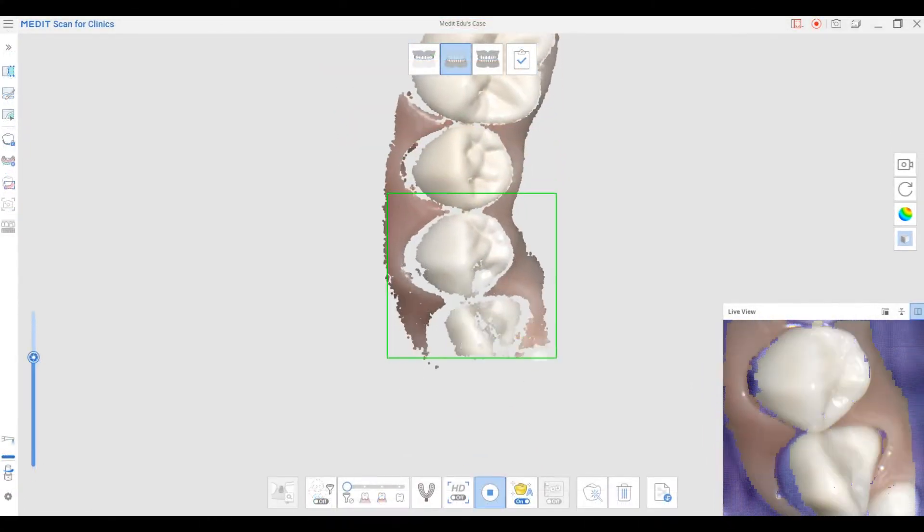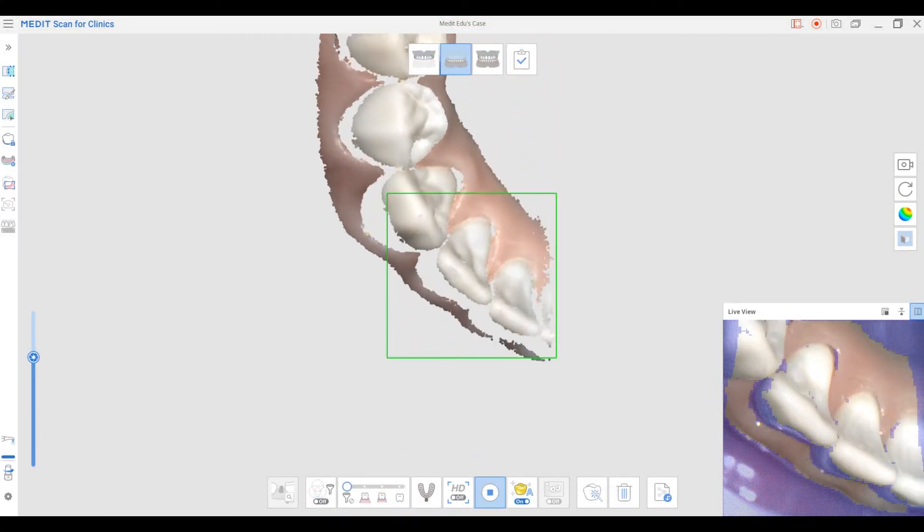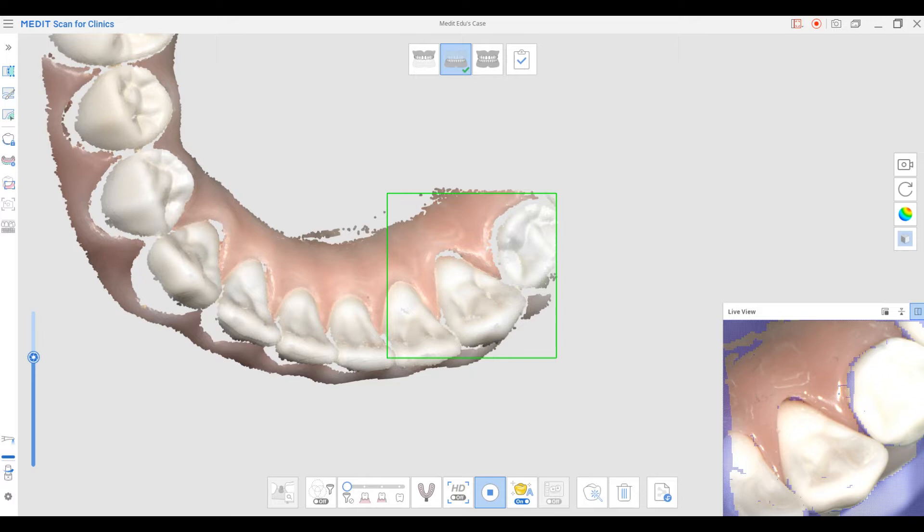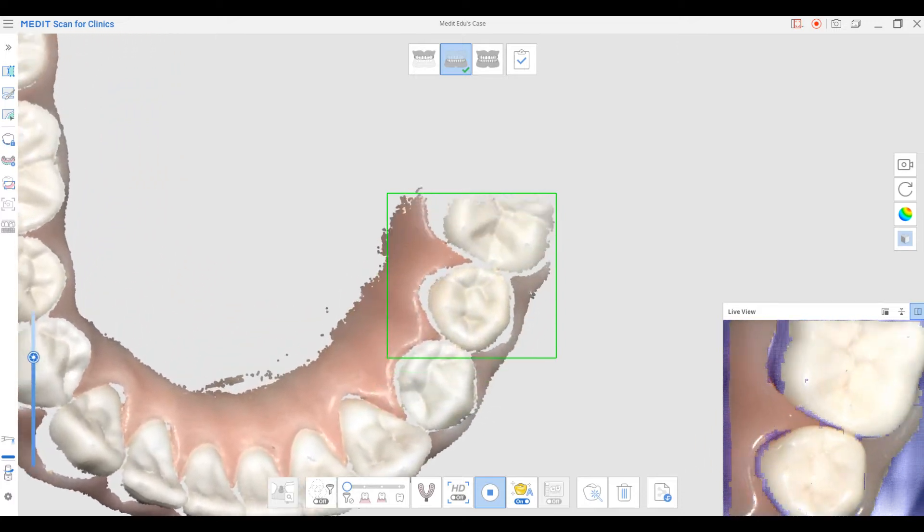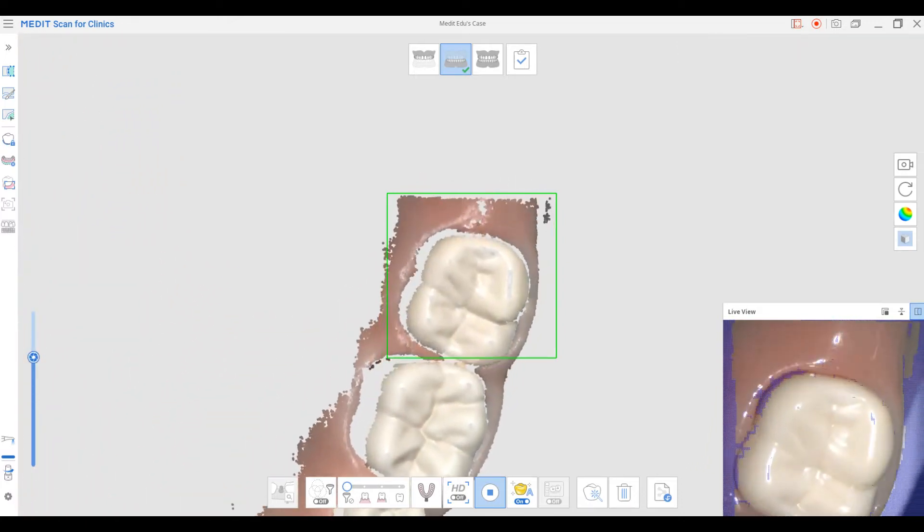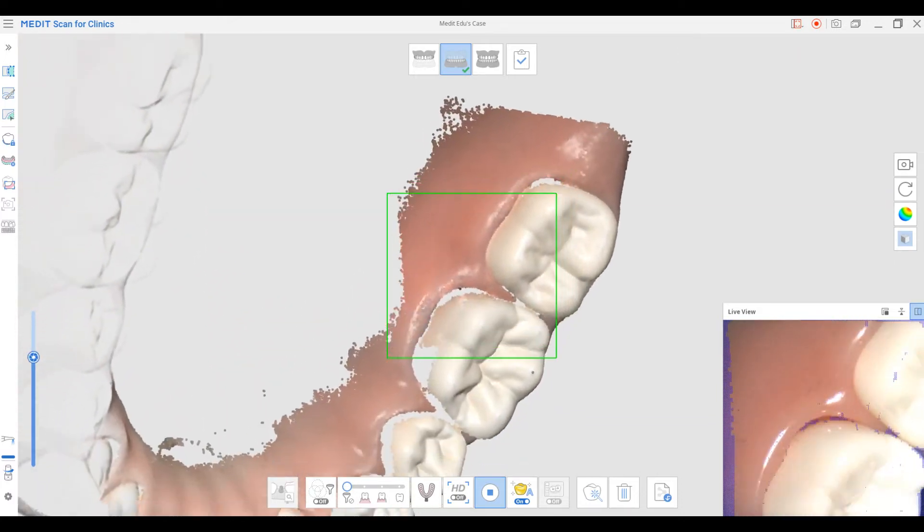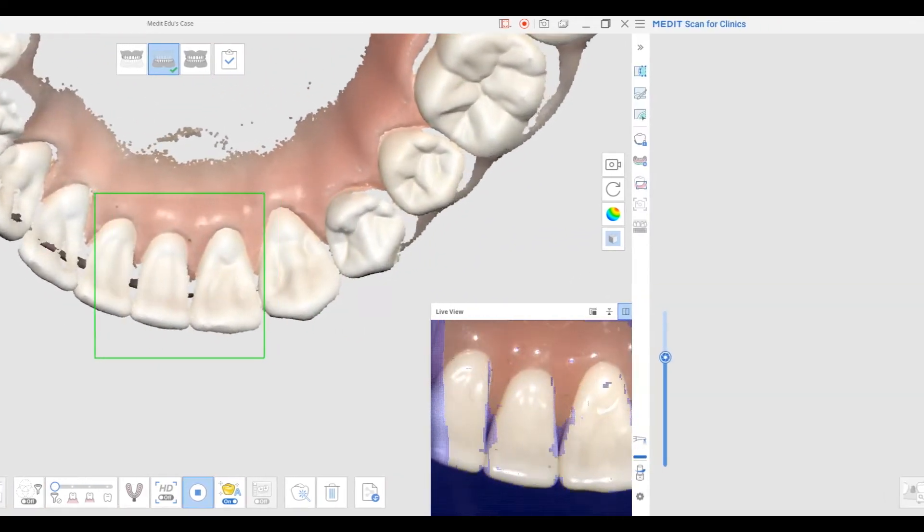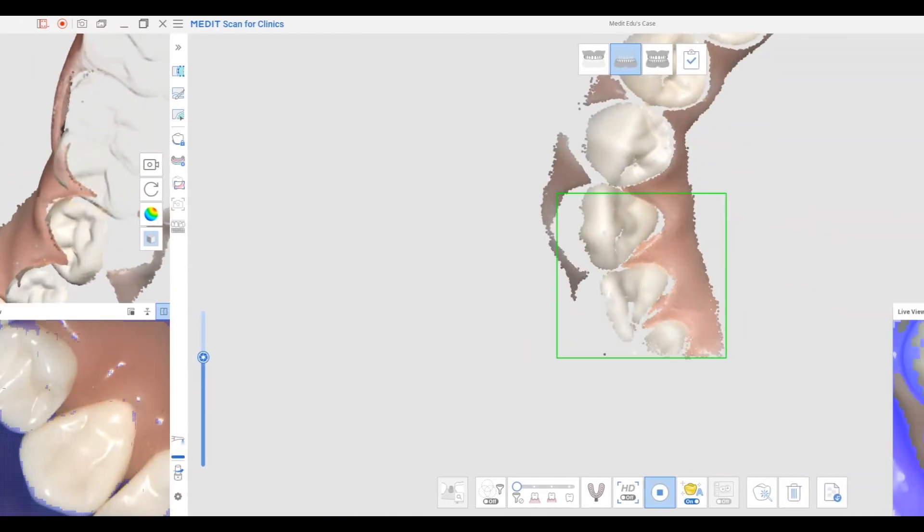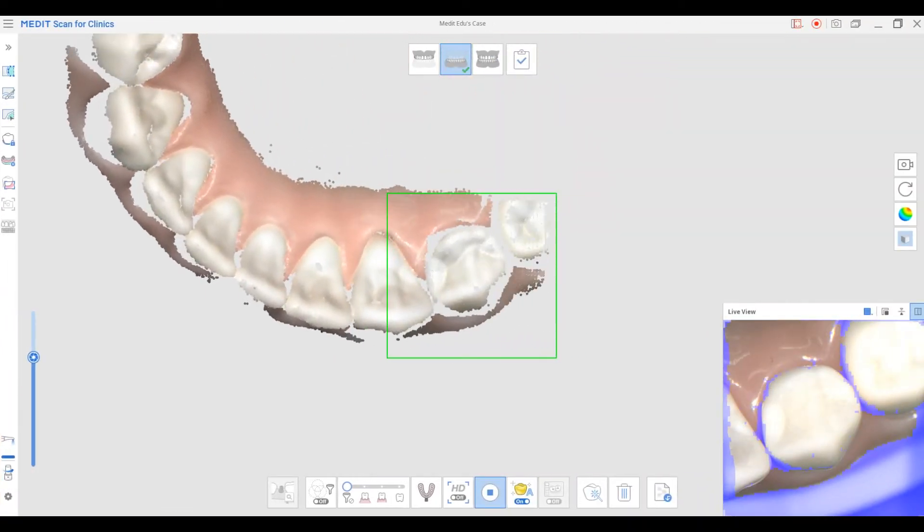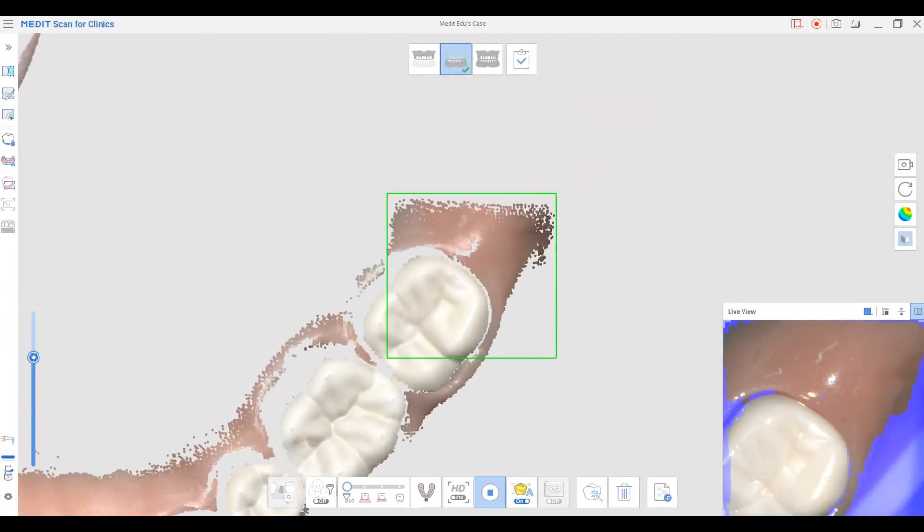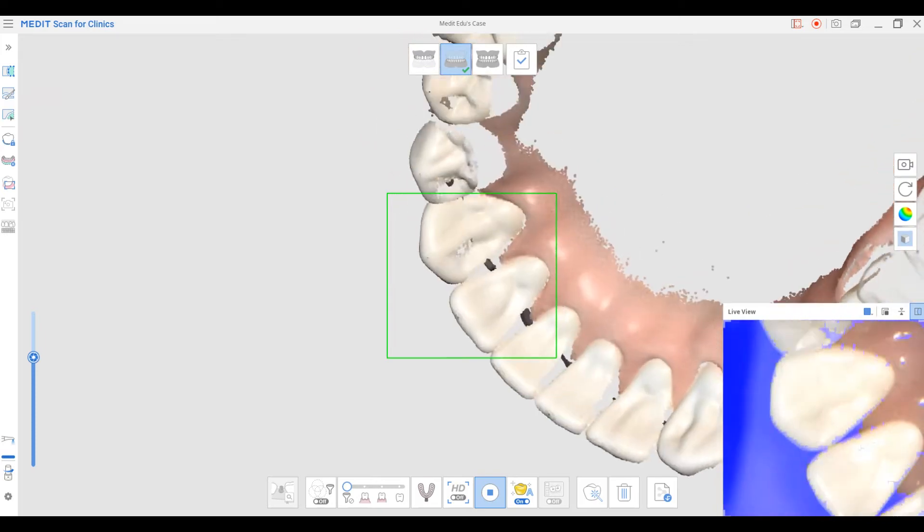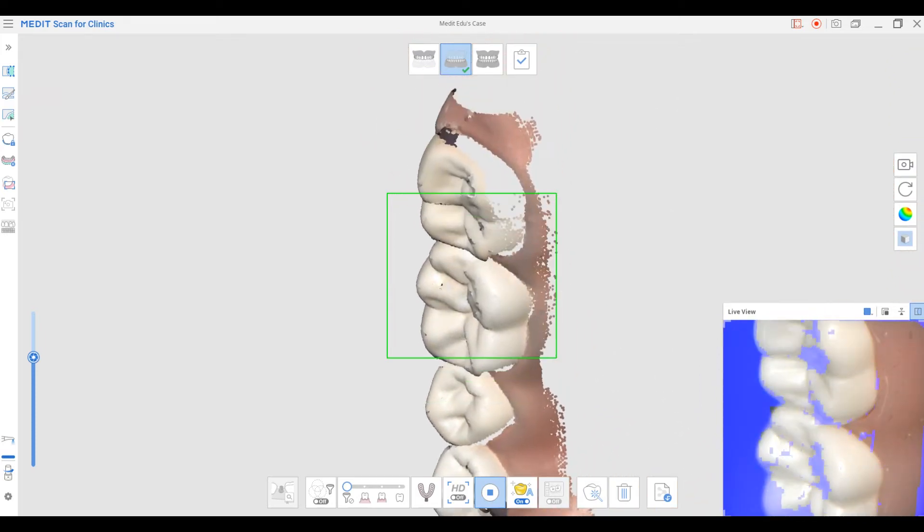With the updated version, you will also see improvements in your scanning performance. We improved the i500 scan data optimization so the acquired scan data will be displayed more smoothly.